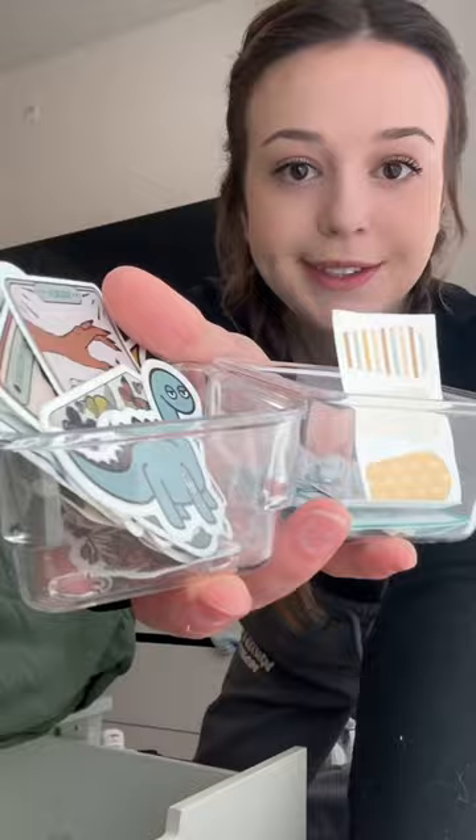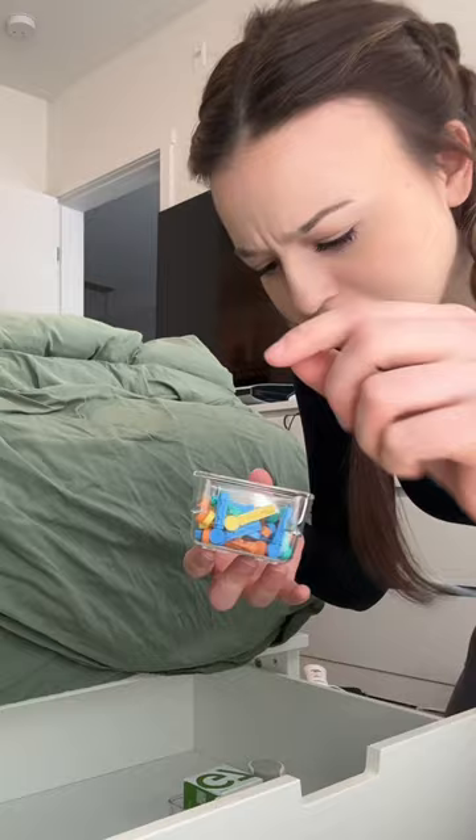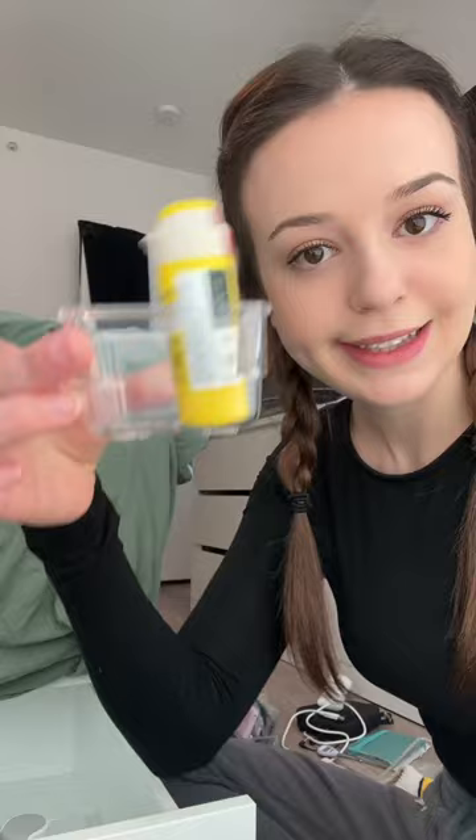I'm also gonna use this container. My last bottle of test strips. Regisole and Skintac stickers, which I have something on the way - so get excited. Needles for my injections. I just saw one without the cap on, so we're gonna get rid of that one. My glucagon in this little thing. Backup testing kits that I actually end up using a lot.